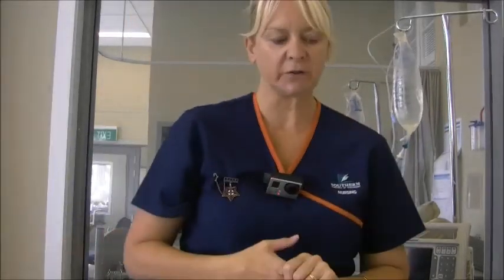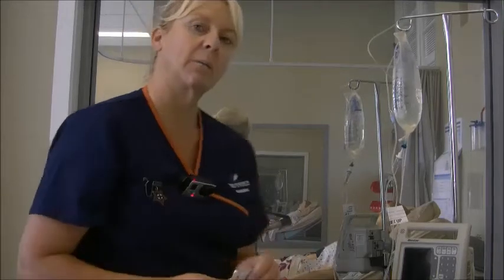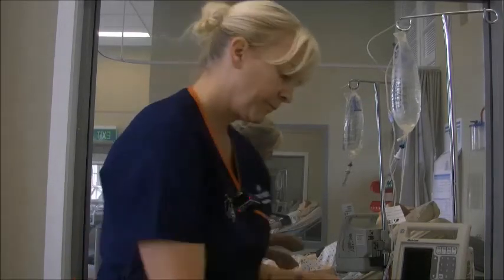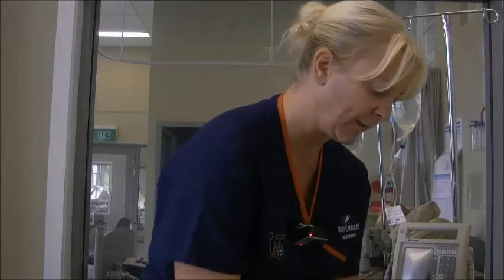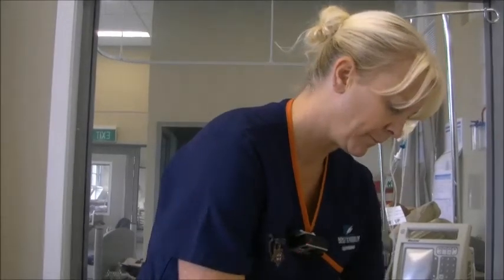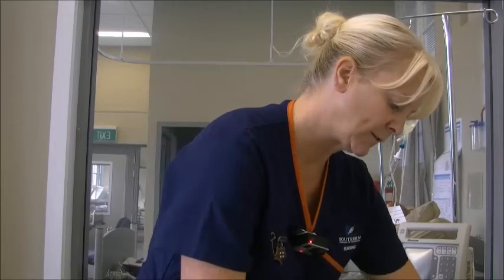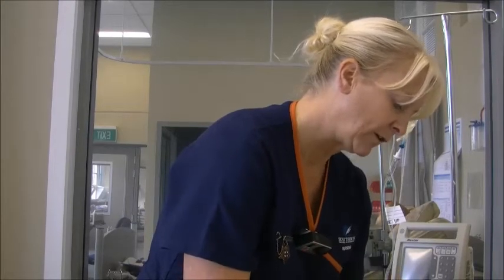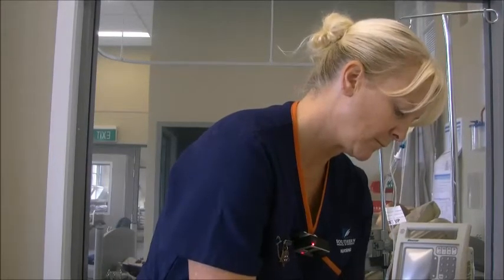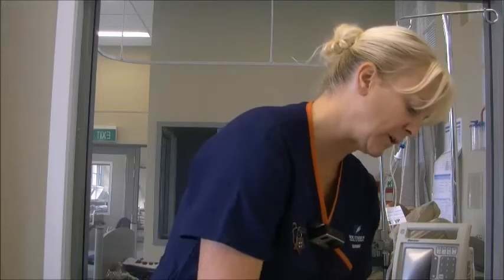Okay, so the next thing that you want to do is make sure that your IV is accessible, and that you scrub the hub, which is what you really need to do prior to putting anything through the IV. So I've got the hub of the interlink, and I'm going to give that a really good scrub. Making sure that you take at least 15 seconds to do this. And it's a really good scrub. And then you're going to let it dry. Okay, so I'm just going to pop that down so it doesn't touch anything, because I've got that nice and clean now.